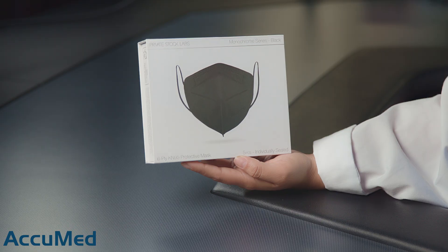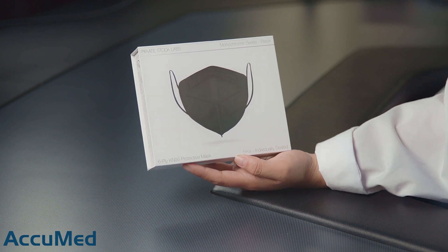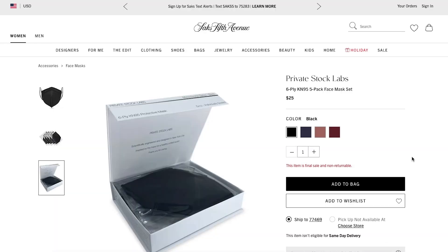Hello everyone and welcome back to the AccuMed channel. Today we're going to be reviewing the Private Stock 6-ply KN95 face mask. This is a set that we bought from Saks Fifth Avenue, and here is the listing.